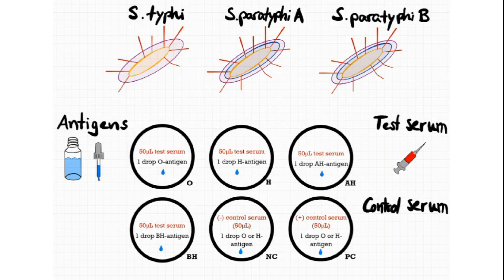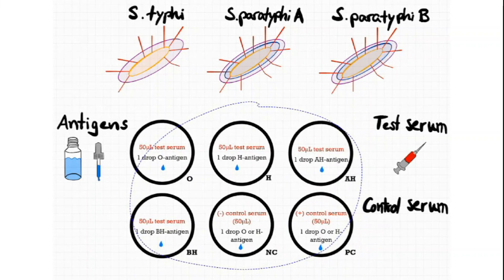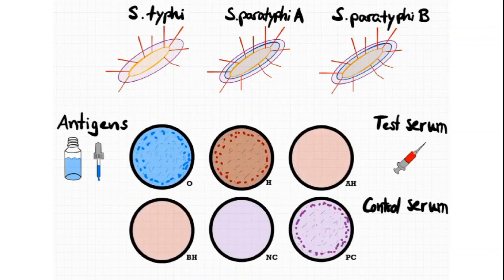After we added everything, we rock the slide for one minute. Here we can see agglutination for the O and H antigen if you compare it to the positive control, so the test is positive for those two antigens. Normally these antigens are included in the test kit together with the control serum as glass pipette dropper bottles. To make it more clear, I drew the bacteria again and took the antigens from them.